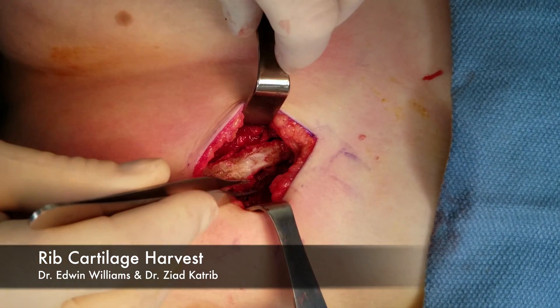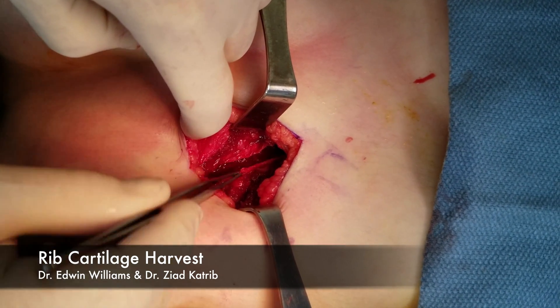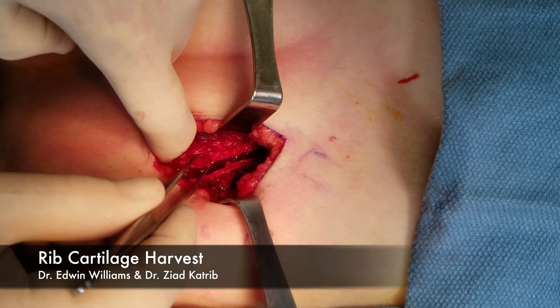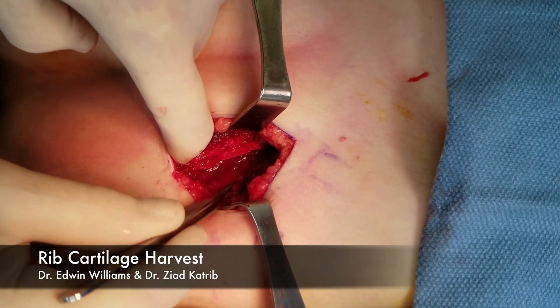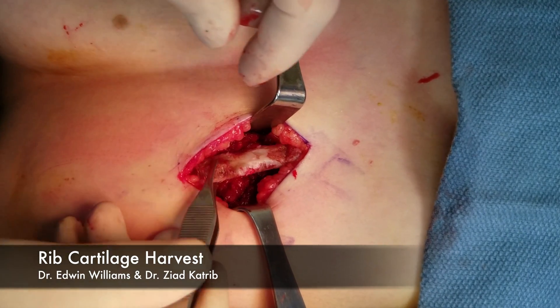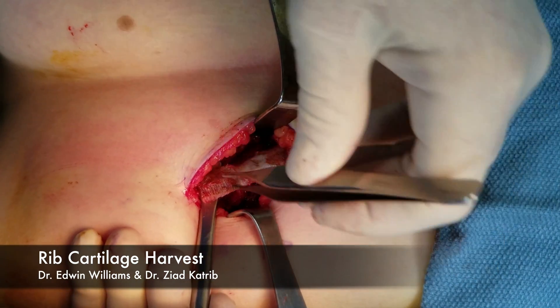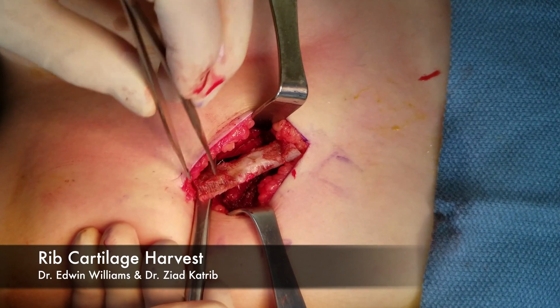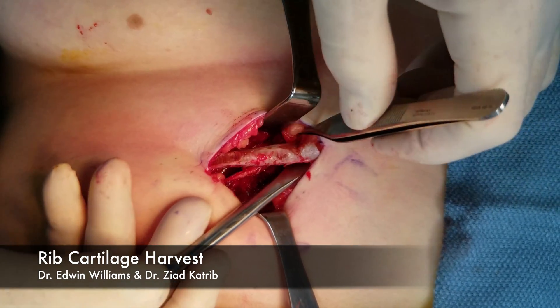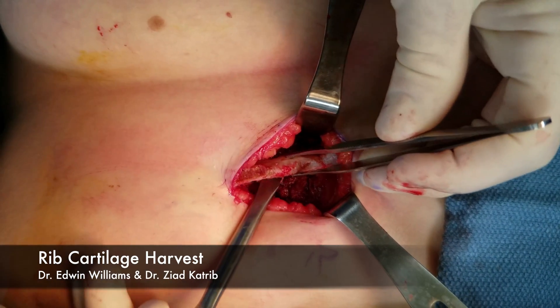What we've got here — taking this rib out — you can actually see the periosteum. That little H: we make a vertical cut here, a vertical cut laterally, and then we elevate this with a freer and just work our way underneath to get it out. Once we get the periosteal elevator all the way under it laterally to the other side, then we make our cut through. We cut down on the blade and just slowly keep working our way medially and do the same thing. Then I retract it medially, cut across it, and take it out.